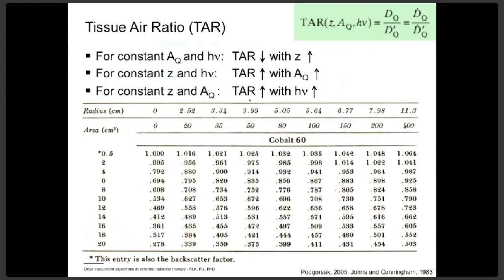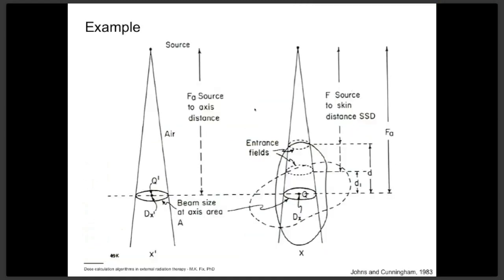So now I would come to an example to show why it's an advantage for certain situations to have such tissue-air ratio tables available, and why the most correction-based algorithm use this tissue-air ratio for estimation of the dose in water. And this is the example.